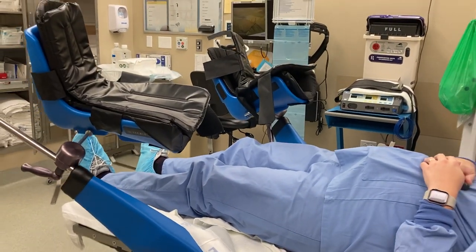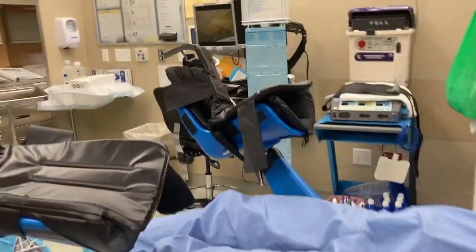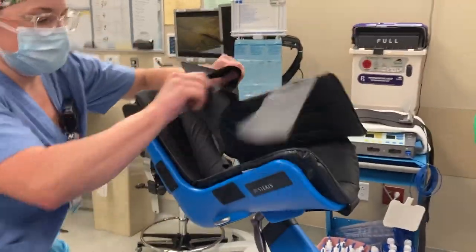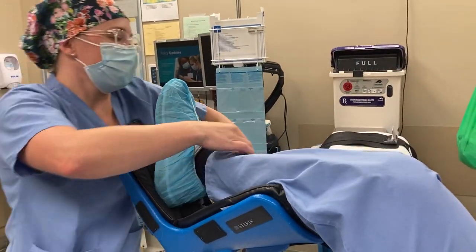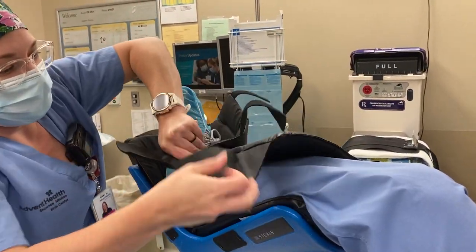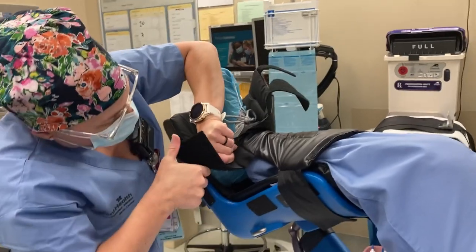So let's put her legs up. The boots have a layer to protect the skin. You lift that top layer up, wrap it over her legs, and Velcro it in.